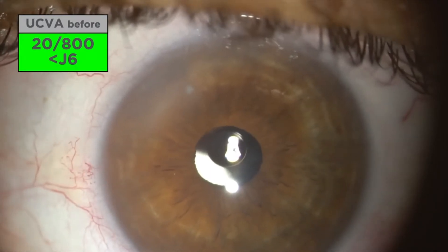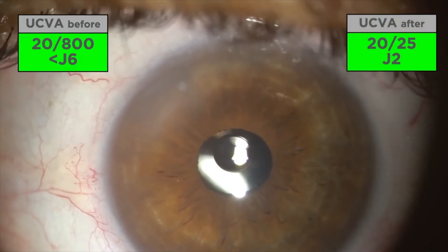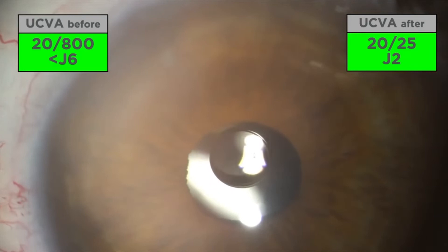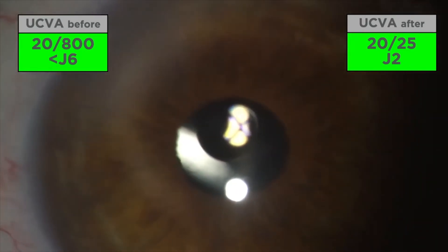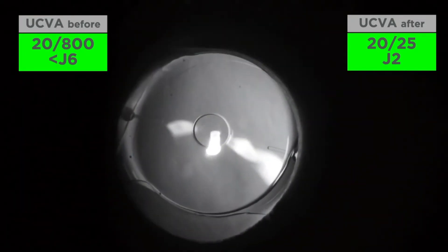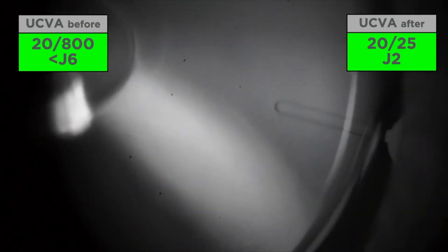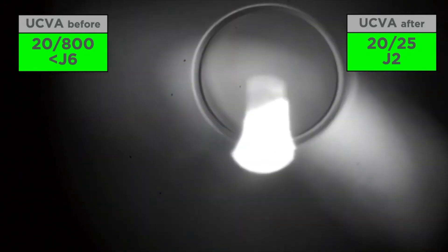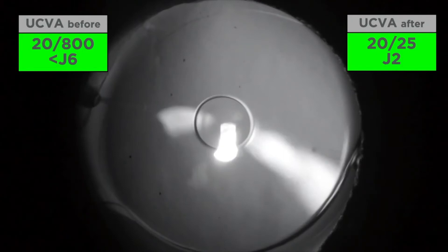The day after surgery, the patient reported incredible vision — 20/25 J2 uncorrected. He said the sharpness was pretty much equivalent to the rigid contacts he had tried. Interestingly, the black acrylic of the pinhole is transparent to infrared, so with an infrared camera mounted on the slit lamp you can see the toric marks behind the black implant. We were checking to confirm the toric IOL was in the correct position — and it was indeed.